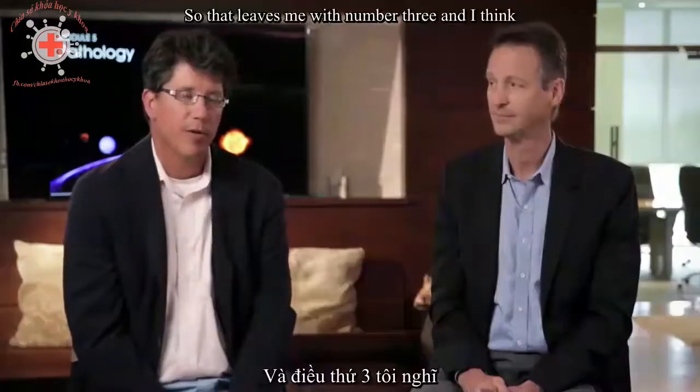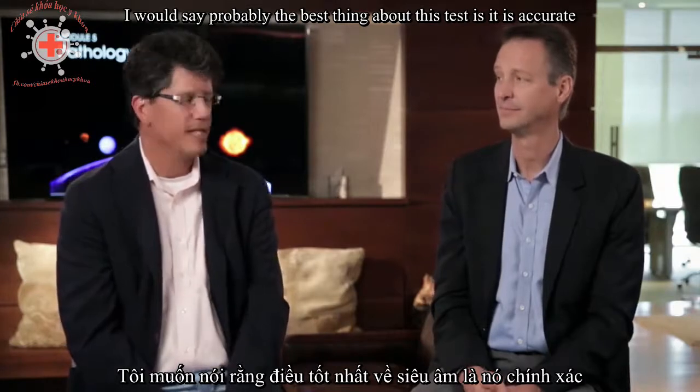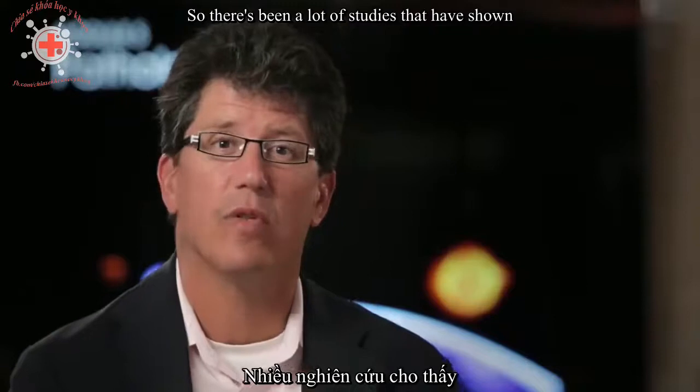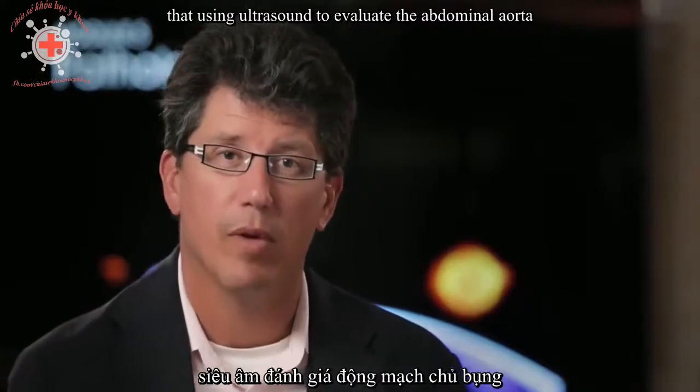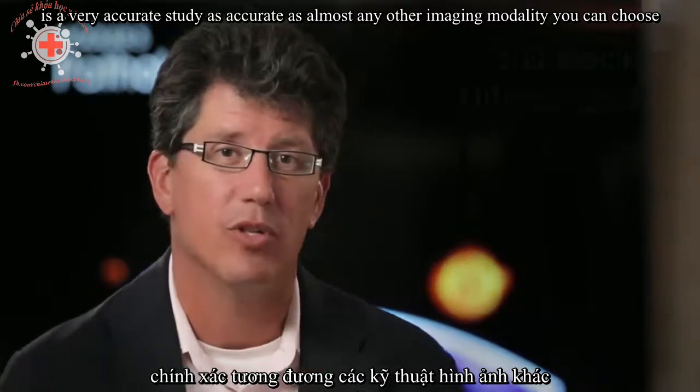That leaves me with number 3, and I think probably the best thing about this test is that it is accurate. There have been a lot of studies that have shown that using ultrasound to evaluate the abdominal aorta is a very accurate study, as accurate as almost any other imaging modality you can choose.